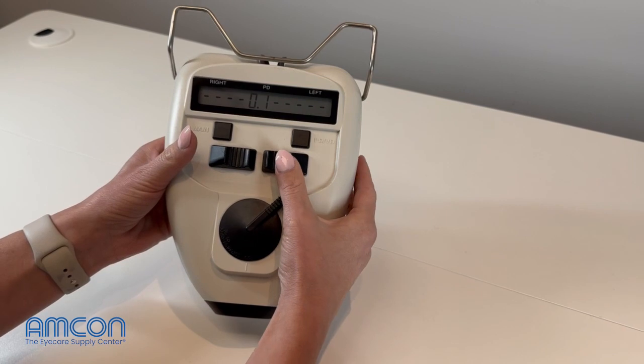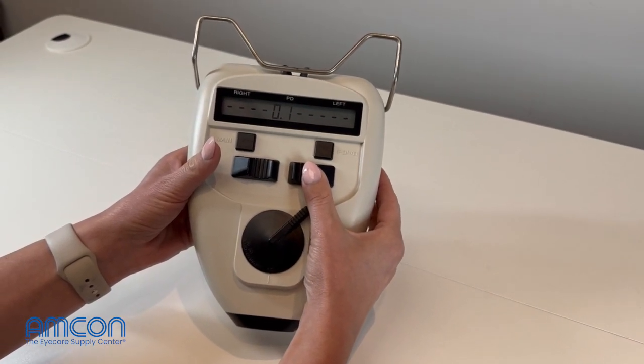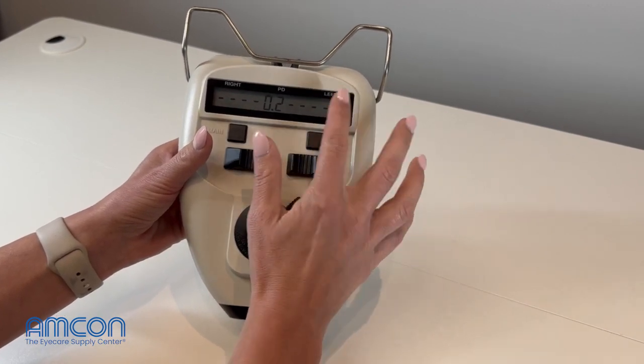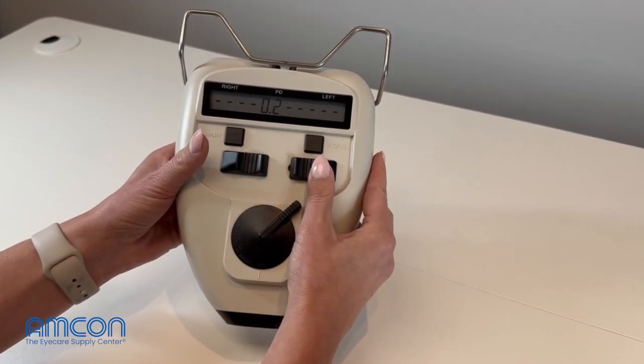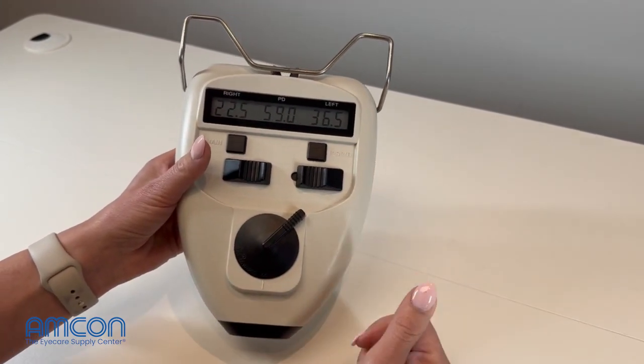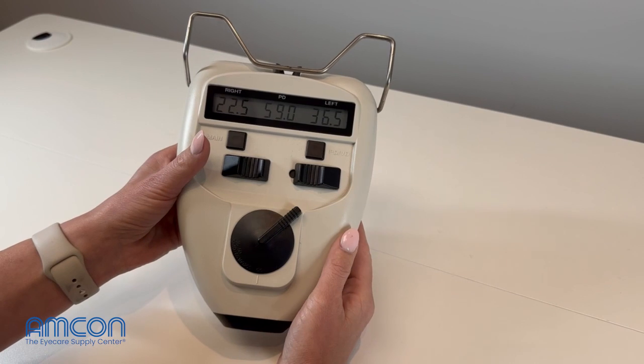You'll see here it says 0.1. Pull this towards the left temple — towards the patient's left. You'll see that changes to 0.2 and then it's going to change to 0.5. This is where you want it to be. Set that by pressing the button again.